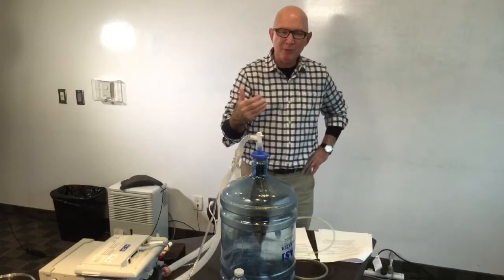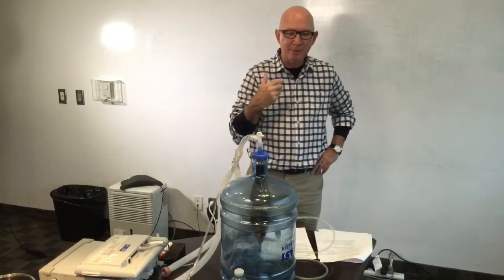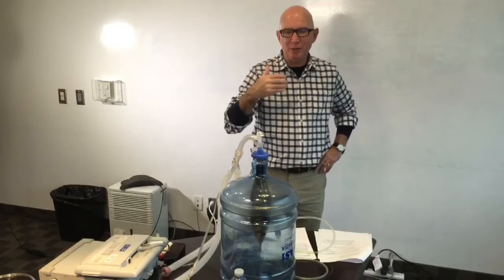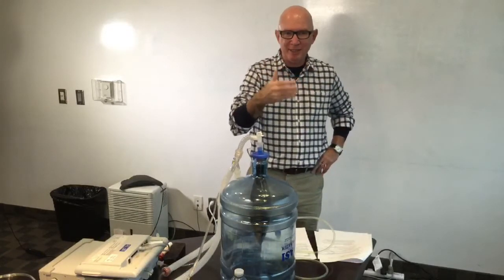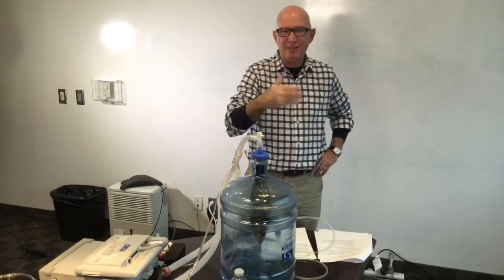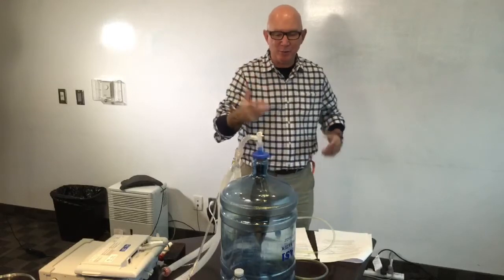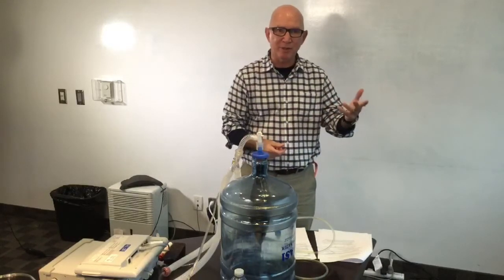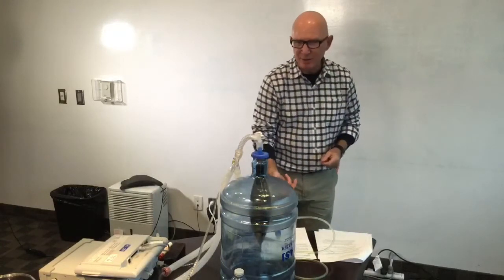Just keep in mind as well, we never go less than 4 mL per kilogram ideal body weight. The reason for that is that we have to have an acceptable dead space to tidal volume ratio. If we get below that, the CO2 will continue to climb and our patients are going to become extremely acidotic, and they won't survive that kind of ventilation. So we can't ventilate someone with less than 4 mL per kilogram ideal body weight. I hope that answered that particular question.